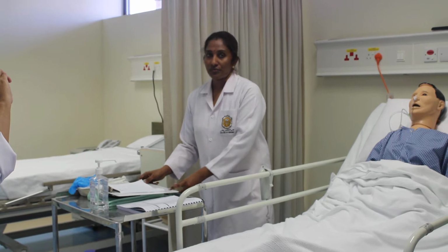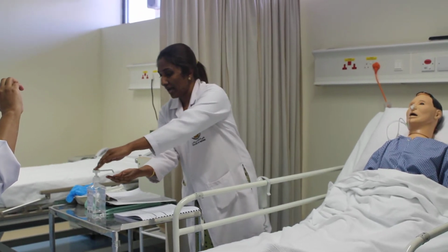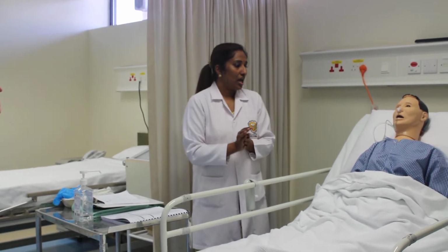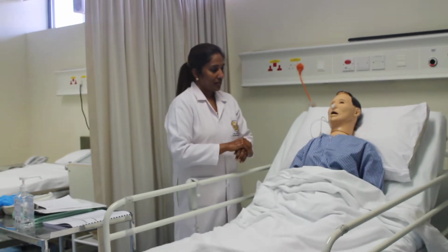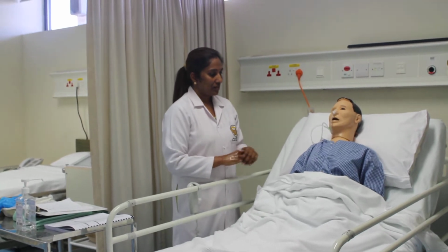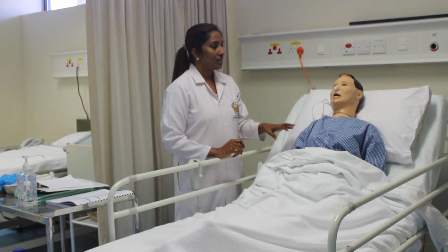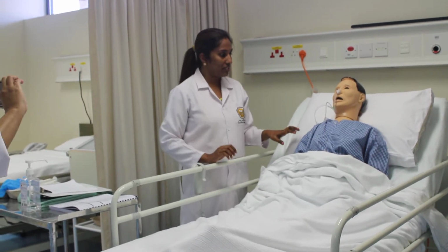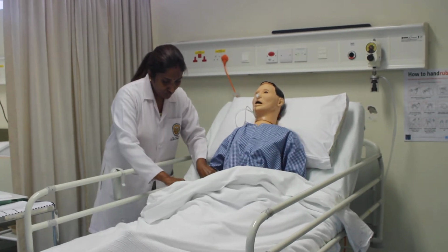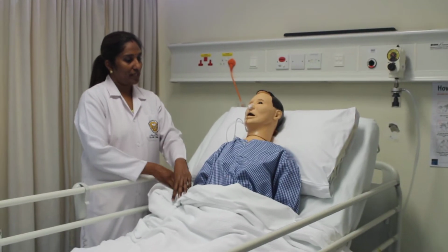Same like any other procedure, you have to make sure that you have done the hand hygiene and you have to introduce yourself. Hello sir, how are you? We are happy to notice that you started eating by yourself, your swallowing difficulty has reduced. So we have decided to remove the NG tube. I will be just checking your ID band. Please tell me your full name. Muhammad Ali. Okay, Muhammad Ali, you are my right patient.